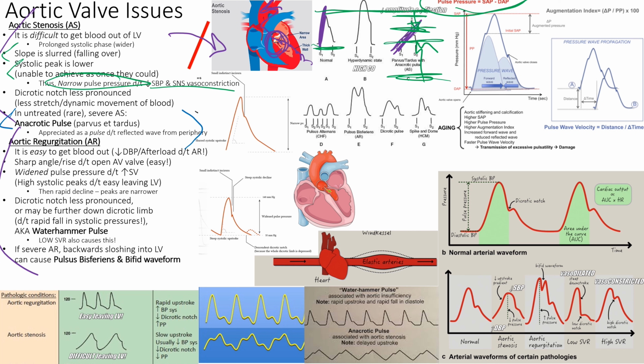If you don't treat it and they have severe aortic stenosis, you can see like a unique waveform where it looks like you have almost like two impulses happening. It's a little bifid waveform. But usually they get this fixed before they see it, because it's going to hit the periphery late, and it's almost disassociated. It looks like they're almost separated, right?